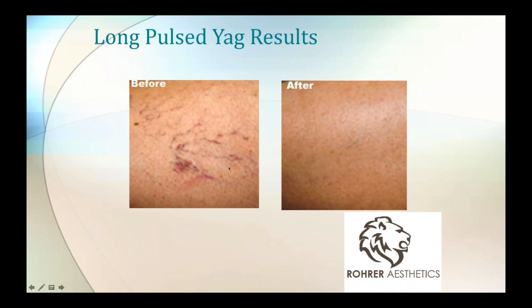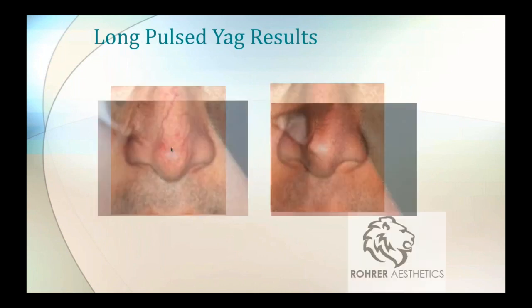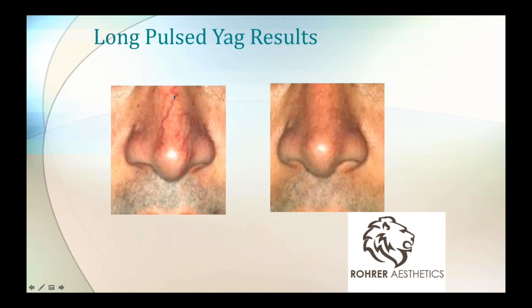If this is on somebody's thigh even, but if this was on their cheek, what you do is you use the long pulse YAG, and you just paint right along the vessel here, and you can watch it obliterate, and you can adjust your energy so that you essentially get no surface irregularities, but you just get the vessel. Sometimes you have to retreat them if they recanalize, but this is very effective for small vessels. This is a small spider angioma, and I could expect getting this result with one treatment, popping that once or 2 times with the long pulse YAG. Similar here, you just paint right along, follow the vessel, and that takes care of that.